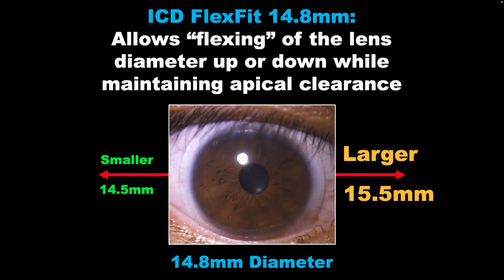For instance, if you achieve like 300 microns when you are fitting the lens and you are okay with that 300 microns, which can vary from practitioner to practitioner, because for me, my go-to would be like a 350, just because I would like the lens to settle between 100 and 150 microns, and that's why I would choose a 350.